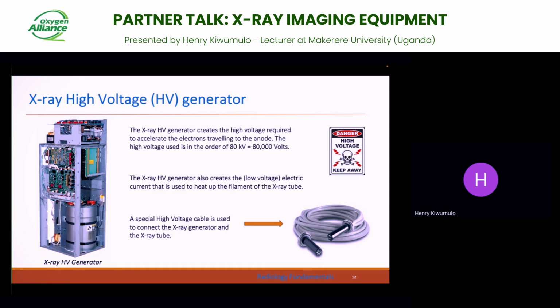This generator has what we call high voltage cables. As you hear high voltage, they support the high voltage that is generated, and they get connected from the X-ray generator to the X-ray tube.